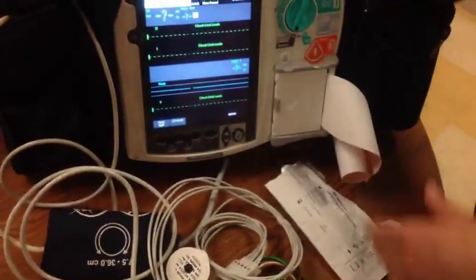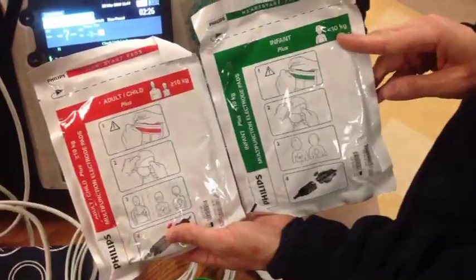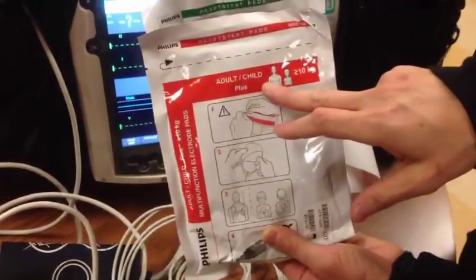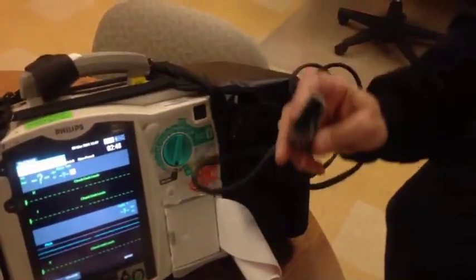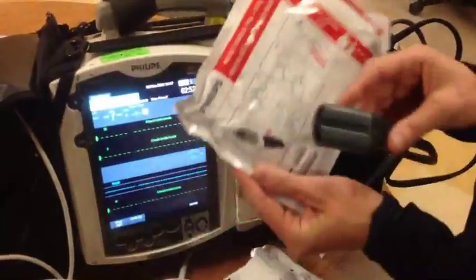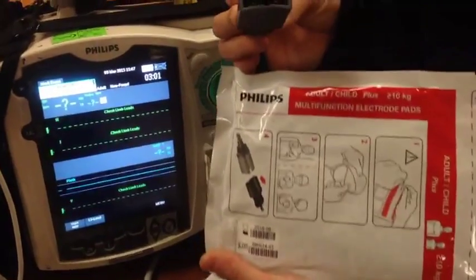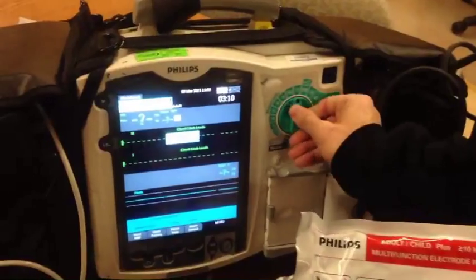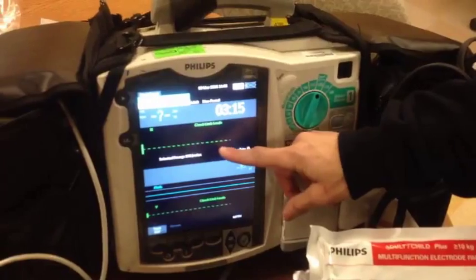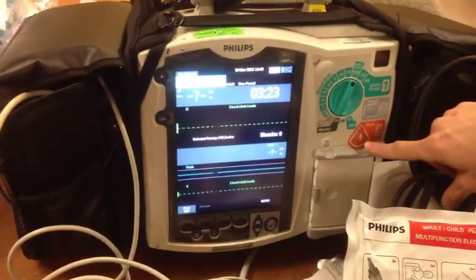If you have to defibrillate a patient, you would pull out your defibrillation pads. The green package is for infant — less than 10 kilograms — whereas the red package is for adult and child, and the child has to be greater than 10 kilos. The connector inside the package gets connected right into the gray port — the connector is black and simply plugs in one way, because the top part is rounded. Once you plug in, you go to your adult dose setting, connect the pads, then hit charge and deliver your shock.